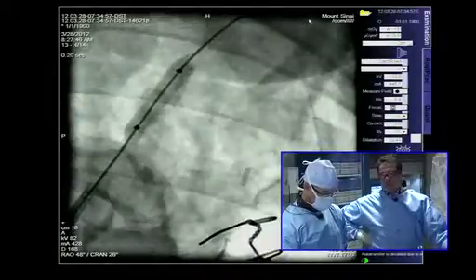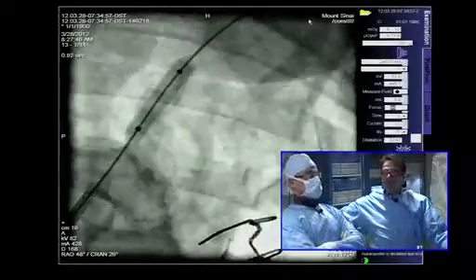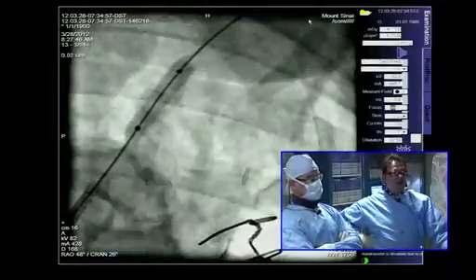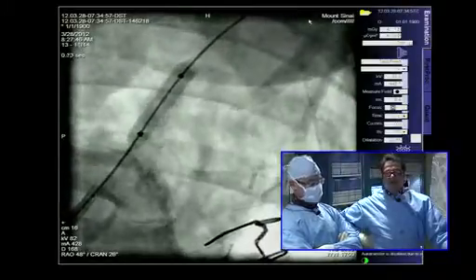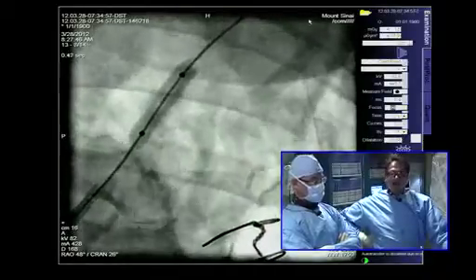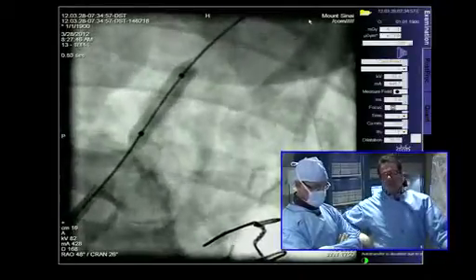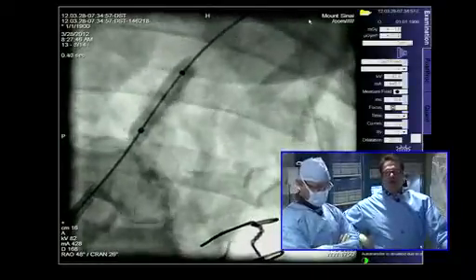The reason why I'm suggesting brachial access in this case is that you need to take into consideration the difficulty that you had advancing a balloon, and now the difficulty you're going to have advancing the stent. Because of that severe calcification, you're going to have tremendous difficulty advancing these things. So if you have a .014 wire on a filter wire, there's no way you're going to be able to deliver this bulky balloon expandable stent on that filter wire. So you would have to think ahead of time and say to yourself, okay, I am going to protect this vert.